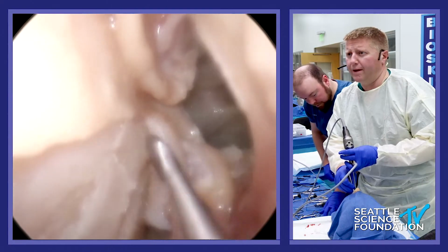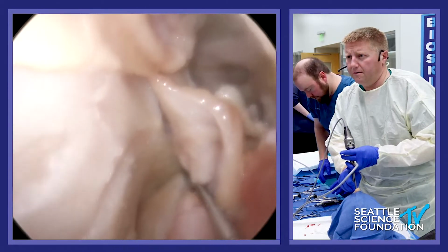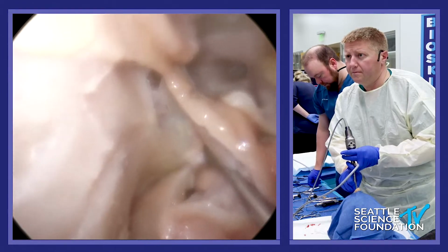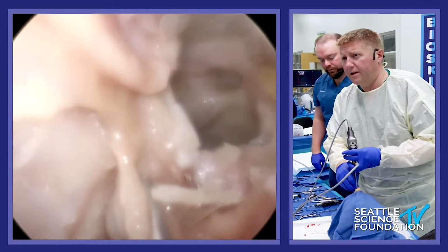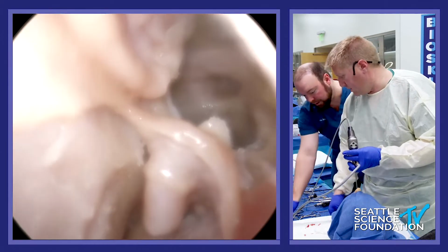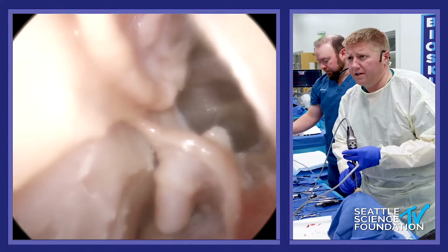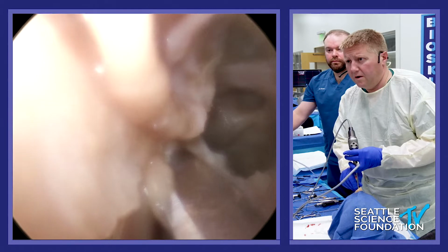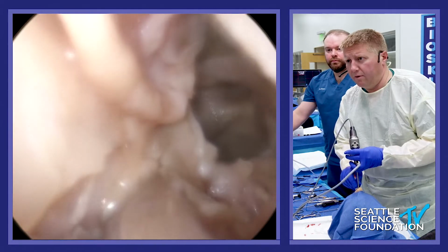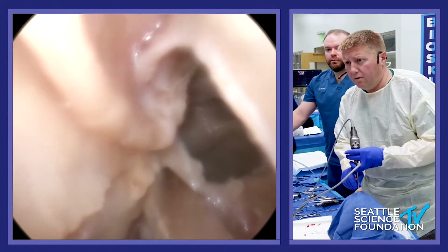And then you're swinging that along the face of your sphenoid. Can I get that 15 blade back, please? Thank you. And again, normally I would make this cut with a needle tip bovie. Here, we'll go ahead and make it with a 15 blade and make sure we're all the way through.